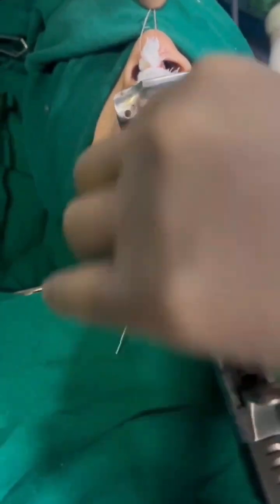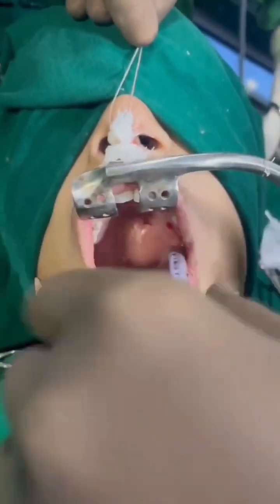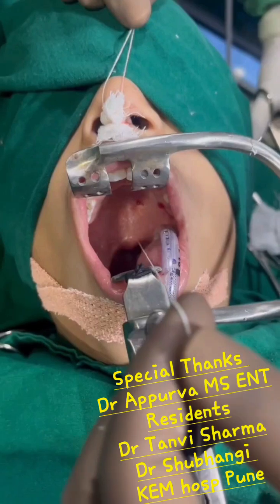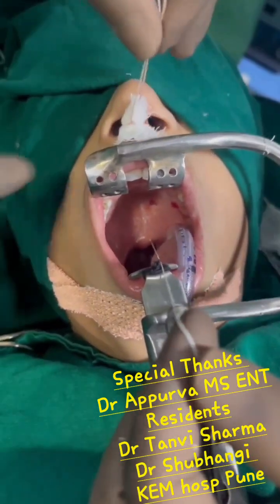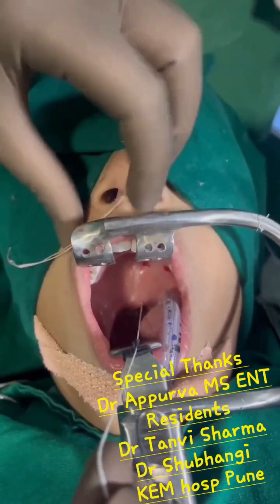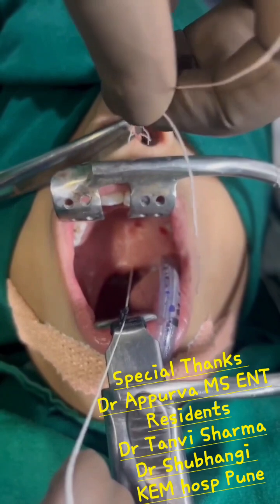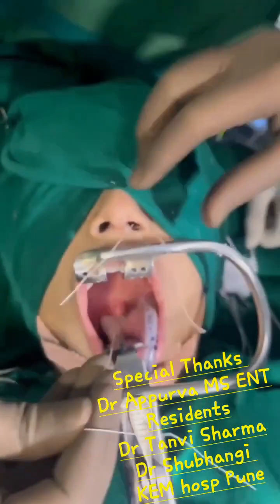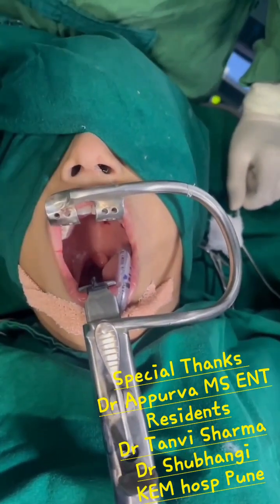We pull out from the oropharynx. We cut it from the center and pull out from the oropharynx. This is how the posterior nasal packing can be taken out. Thank you.